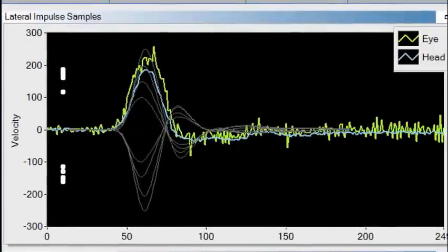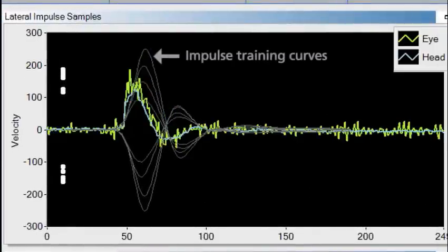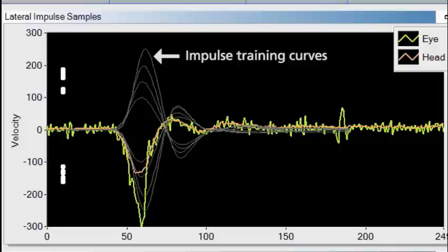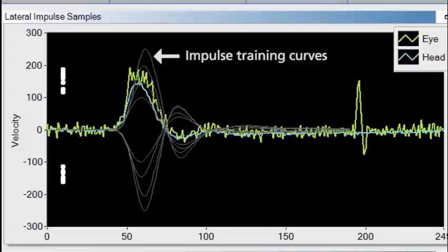The lateral impulse window helps you perform good head impulses. The gray training lines represent the shape of good head impulses at a variety of velocities: 50, 100, 150, and 200.